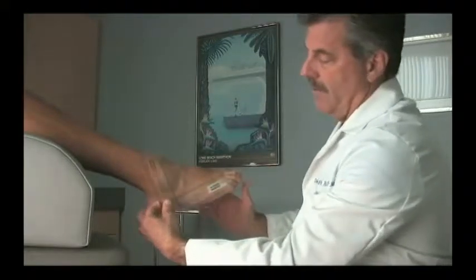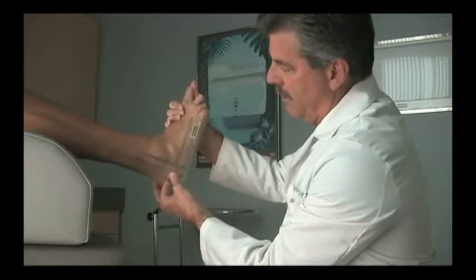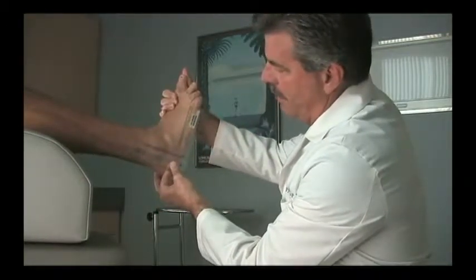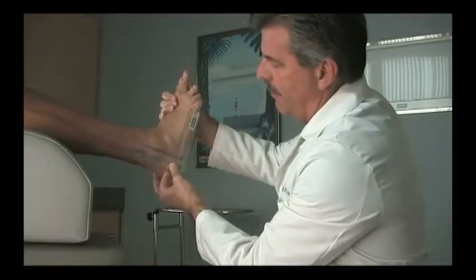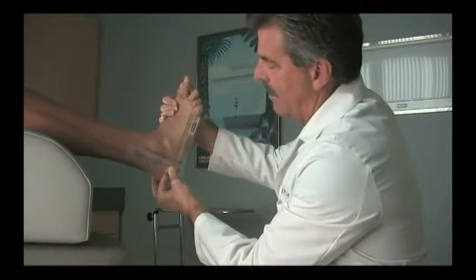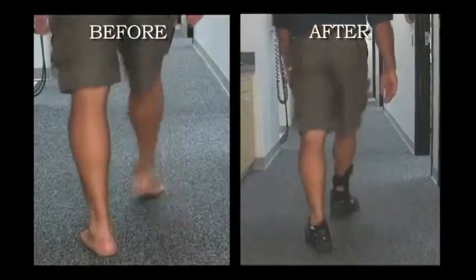With our tractograph set at 90 degrees, and if we load this foot, we can see that with a little bit of effort, we can get the patient just to 90, and there's no spasticity. Therefore, if the patient can achieve 90 degrees, we classify them as not having equinus, and therefore are a candidate for a hinged Dynamic Assist Brace to correct the drop foot deformity.